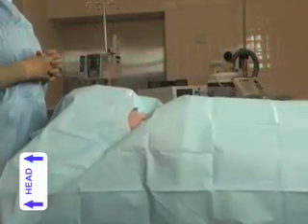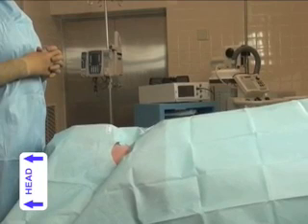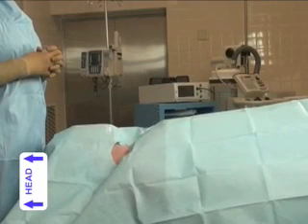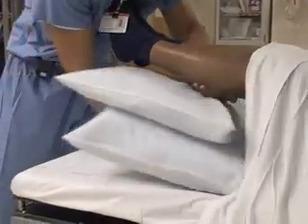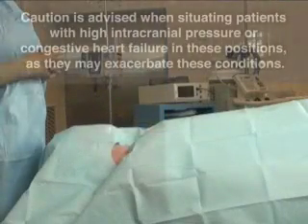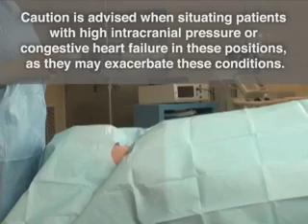Place the patient in the supine position. If the central venous pressure is not elevated, place the patient in the Trendelenburg position, with the head down 10 to 15 degrees, to increase jugular filling and reduce the possibility of air embolism. Alternatively, venous pressure can be elevated by placing a wedge beneath the patient's legs. Caution is advised when situating patients with high intracranial pressure or congestive heart failure in these positions, as they may exacerbate these conditions.